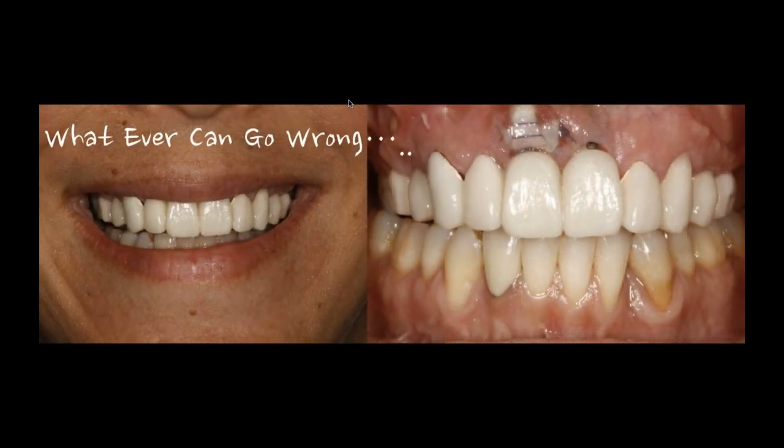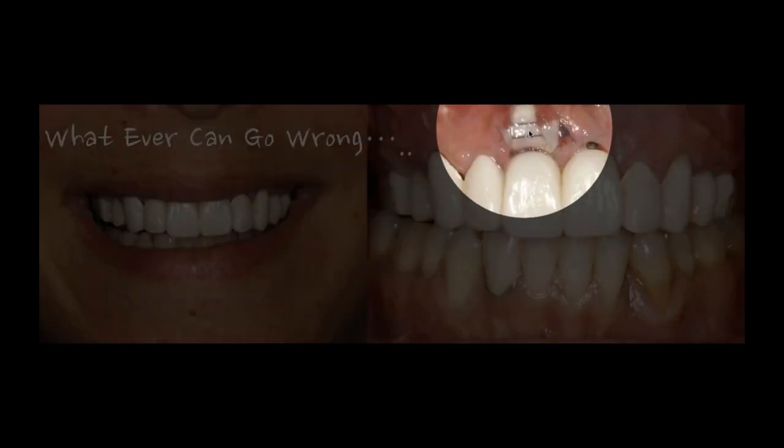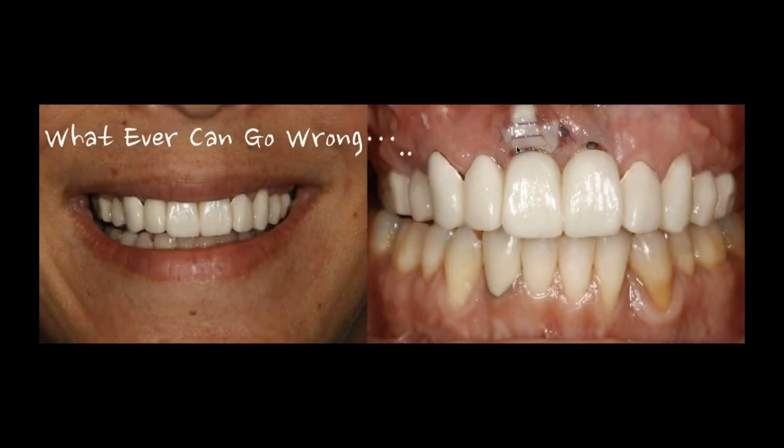And it wasn't too long after that that everything started going worse for us. As soon as those crowns were touched and we made new provisionals, the tissue started pulling up and away. And that became more of a problem. The implant was already exposed to start with. And now we had to go back and try to regraft some bone and some tissue to cover up those implants, which, by the way, I didn't want to use from day one. I wanted to put them to sleep. So we got that kind of managed.